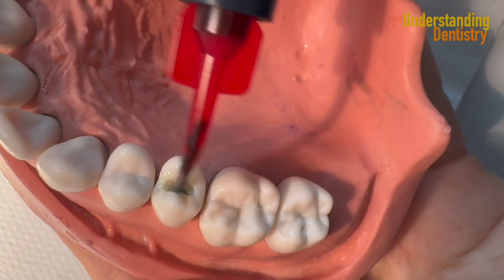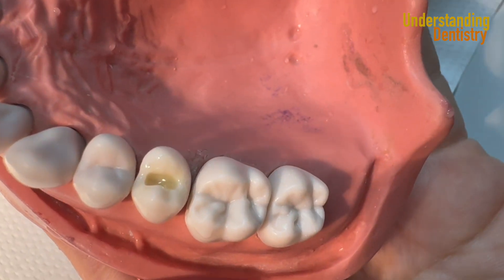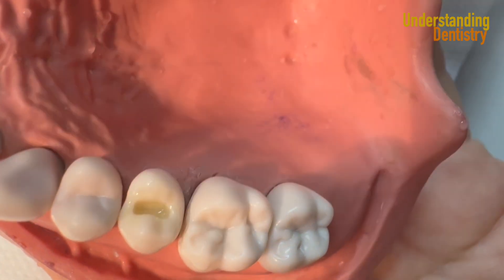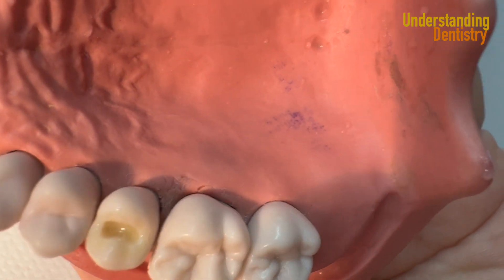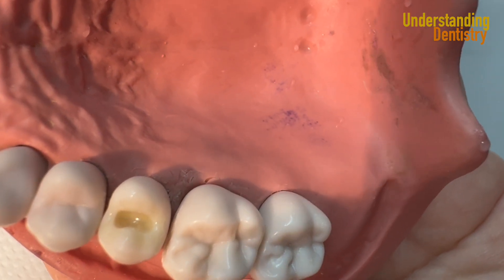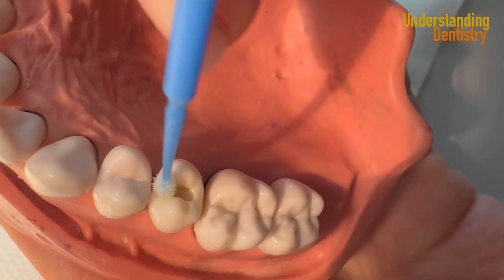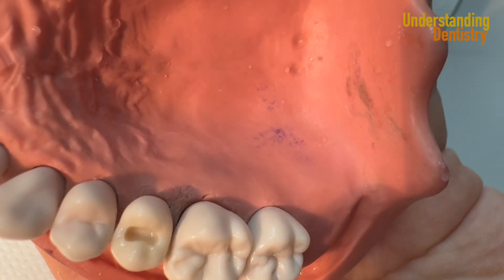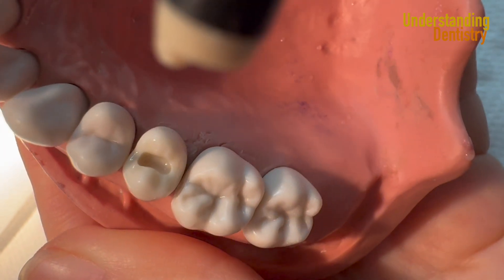Take a look at this bonding material from Ultradent — it has the tip already for you to brush on the surface. It's important to apply and rub on the dentin, rub on the surface. You can remove any excess with a micro brush, just removing a little bit of the excess, and only then you air dry.